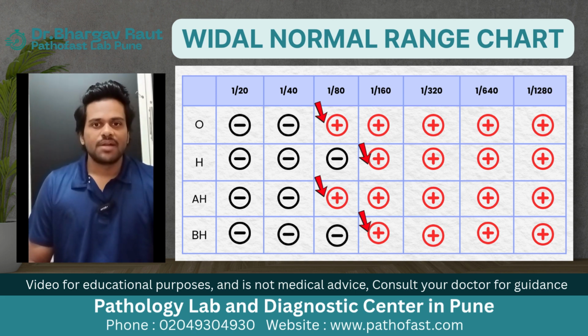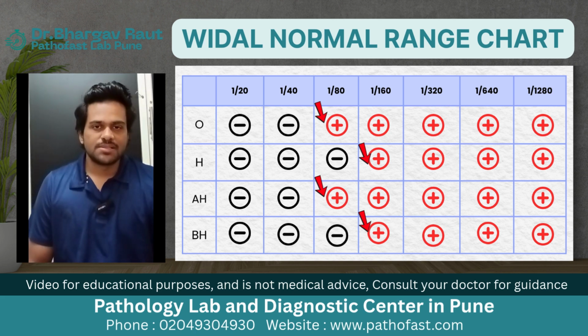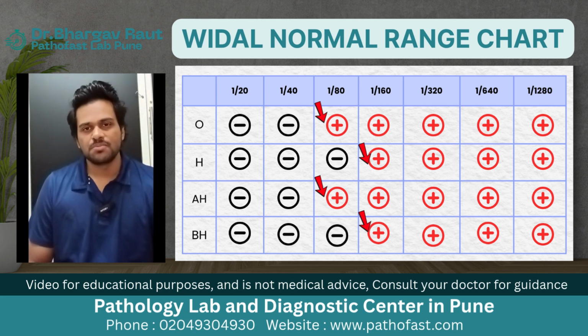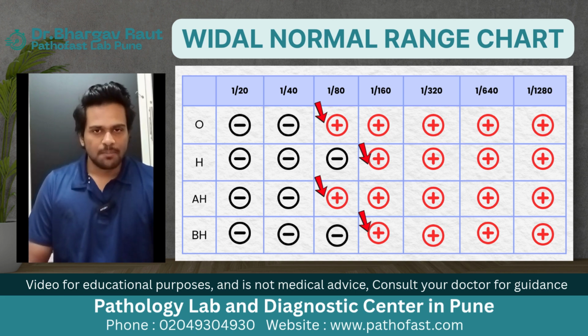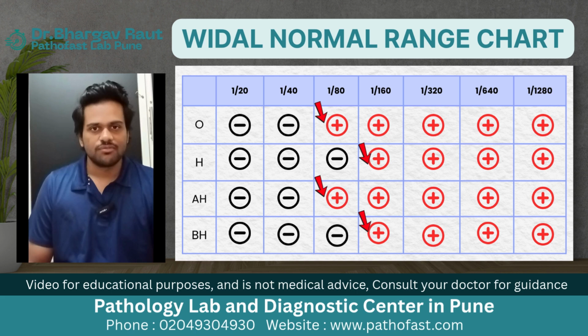We take your sample and we just go on diluting it with more and more saline, so that by the end we've diluted it nearly 1,000-fold, and anything that was present in the original sample will now almost be undetectable. So how does this help? Basically, if antibodies against typhoid are present in your blood in sufficiently high quantities, we will be able to detect them even at a very high level of dilution of your sample. And that's what we use as the cutoffs to say whether you are positive or negative for typhoid.